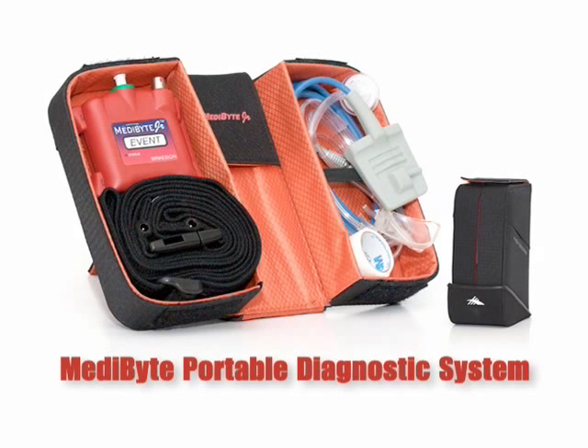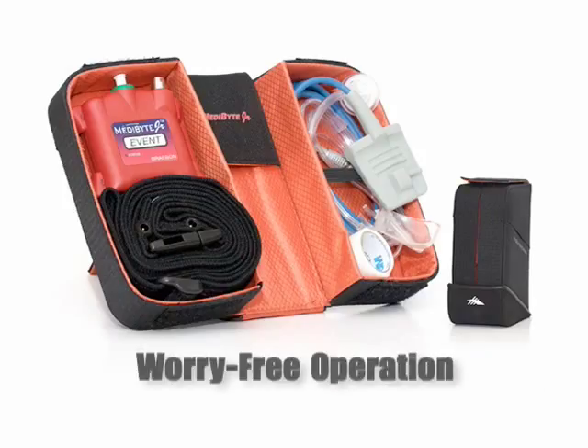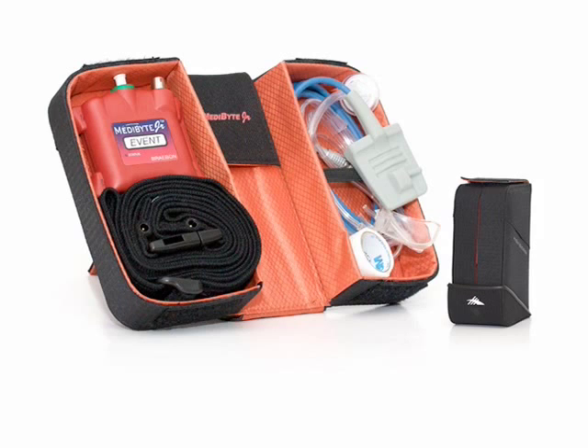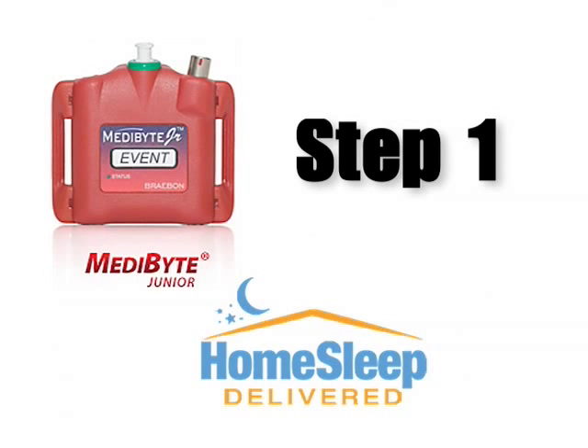The MediByte Portable Diagnostic System is an easy-to-use device that enables you to perform a sleep study in the privacy of your own home. This system has been pre-programmed to the sleep times you've set up with your physician prior to receiving your unit, so you won't have to worry about setting or turning the unit on. Please allow 5 to 10 minutes prior to going to bed to properly set up your unit. Let's begin the step-by-step instructions on how to operate your MediByte system.